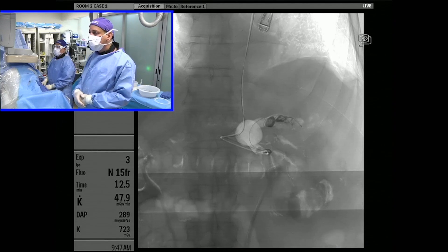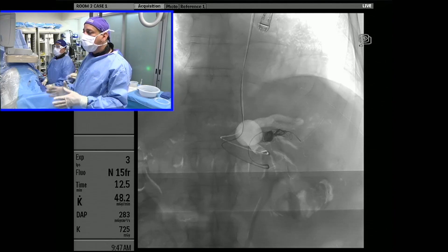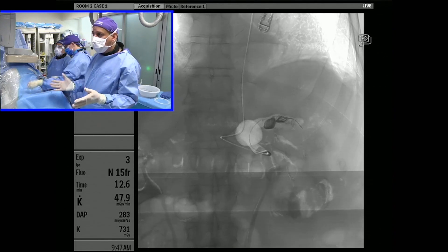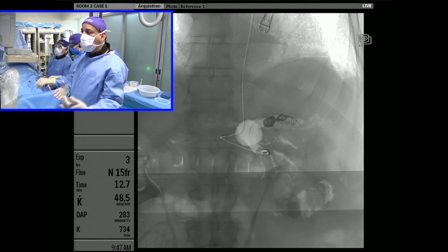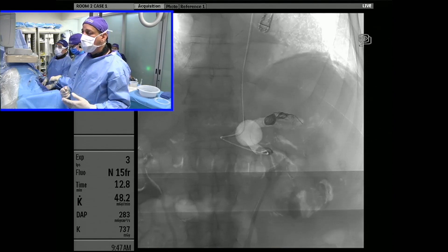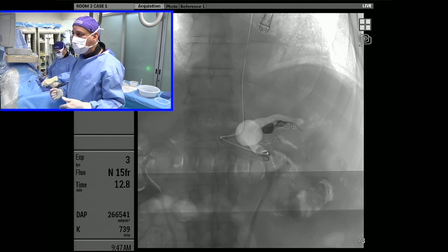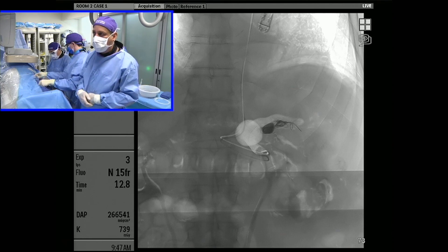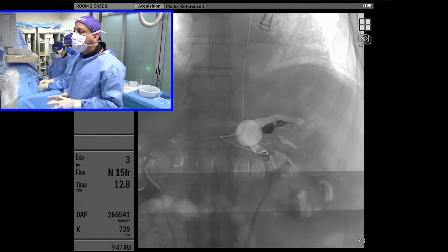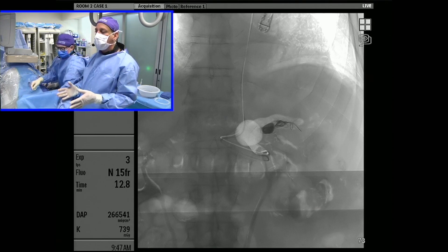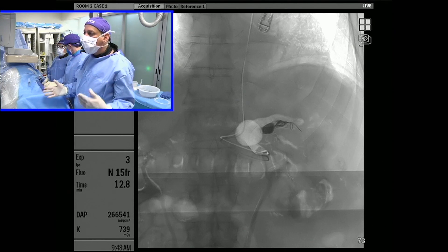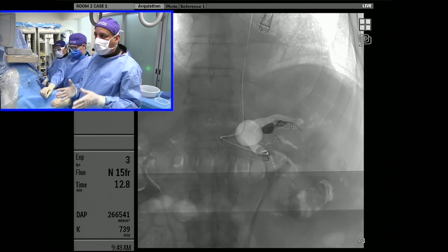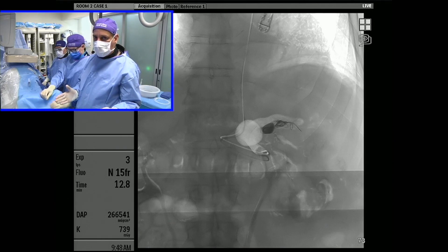What we've evolved into is: once the outflow is sealed, the microcatheter obviously prolapses into the aneurysm. We do not retract it into the inflow at that point — we leave it within the aneurysm and routinely fill up the aneurysm, then let the coil mass kick us out into the inflow, and then we pack the inflow. That's our routine protocol. We don't even explore the concept of avoiding the aneurysm. Additionally — and this is subjective rather than evidence-based — once the aneurysm is sealed, it takes far fewer coils to seal the inflow.